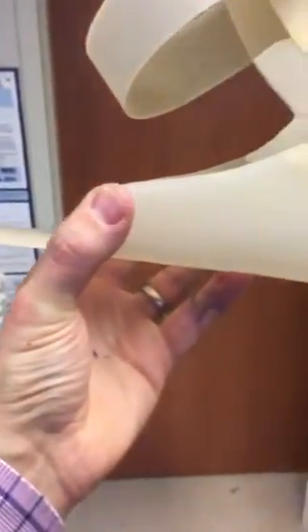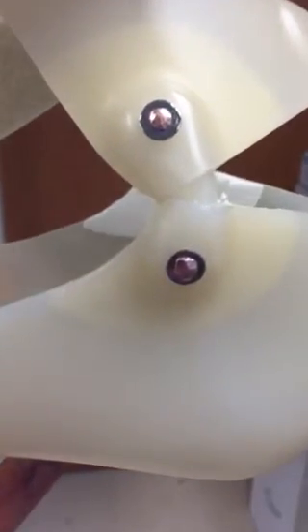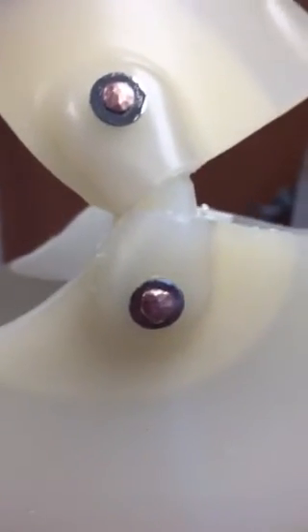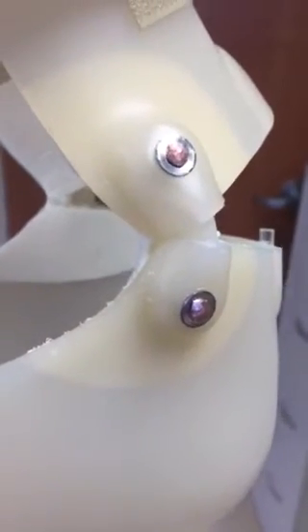In this short video, we just want to show you the most common form of a dorsiflexion assist joint right here. We like to incorporate the use of copper rivets to really hold those joints in there. But if you can see between the two pieces of plastic, there's a joint, and that is called the dorsiflexion assist joint.